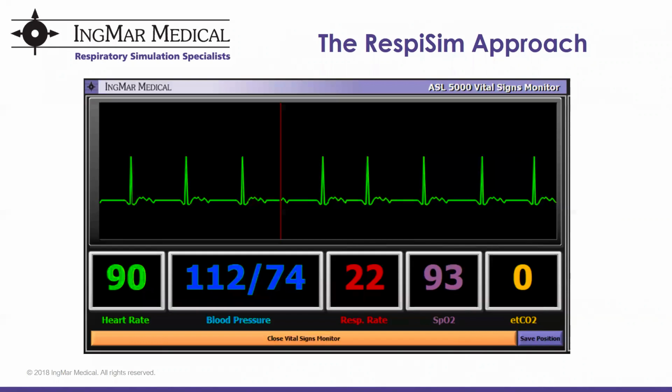So yeah, we have another question related to the vital signs, and maybe I clarified that just now, but just to be as clear as possible, this separate monitor for the student is just a small USB monitor. So it is connected by USB to the main computer that's used by the instructor.